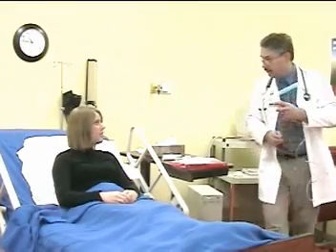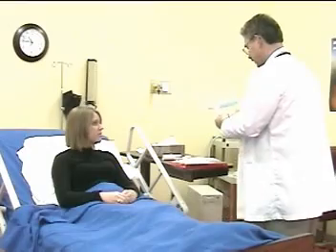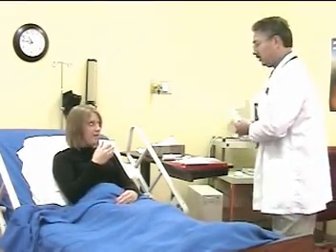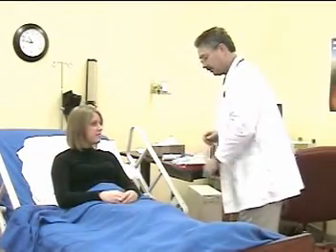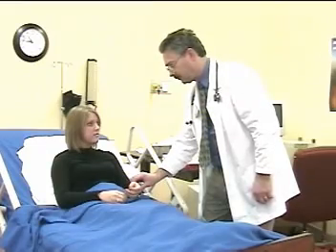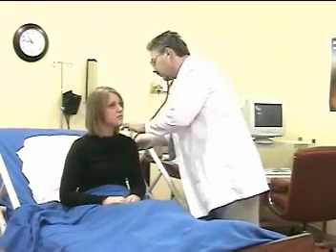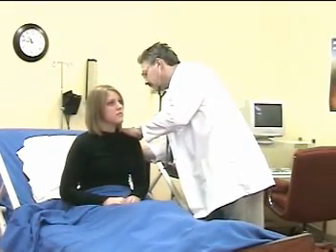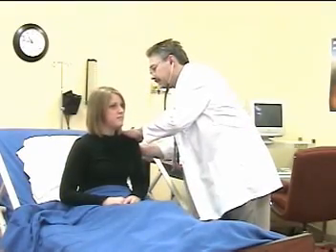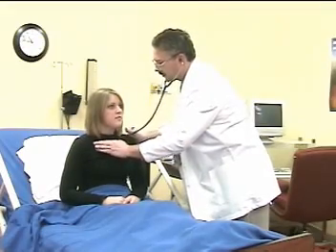How do you feel? A little bit better? The therapist encourages and assists the patient to cough: give me a nice big deep breath and a cough. The therapist monitors therapy effectiveness, takes a pulse rate, and listens to breath sounds again — lean forward. Sounds much better, do you feel that way?